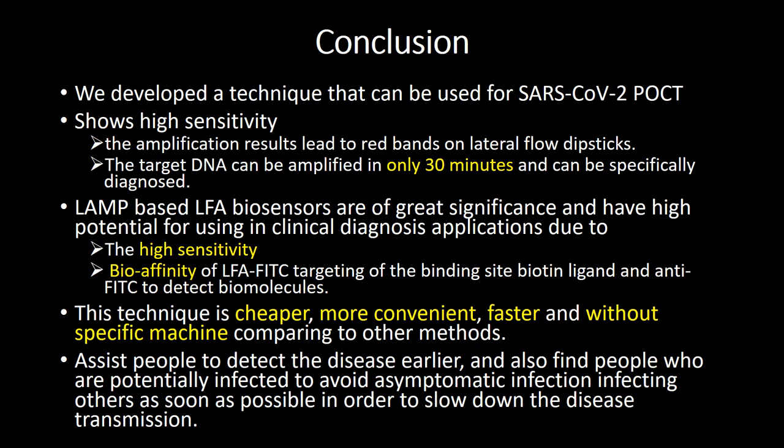bioaffinity of lateral flow assay to FITC targeting of the binding sites, biotin ligand, and anti-FITC to detect biomolecules. This technique is cheaper, more convenient, faster, and without specific machine compared to other methods. It can assist people to detect the disease earlier and also find people who are potentially infected to avoid asymptomatic infection, infecting others as soon as possible in order to slow down the disease transmission.